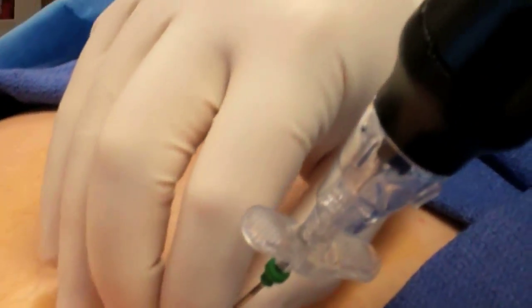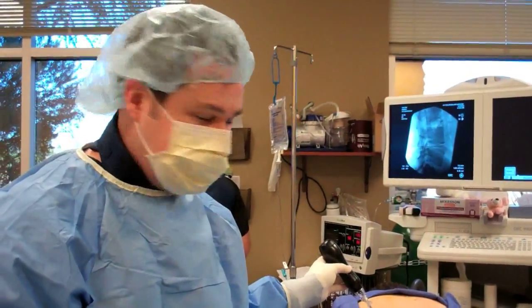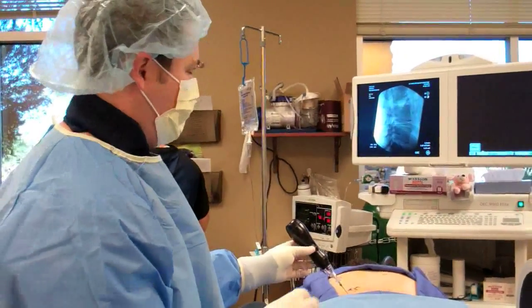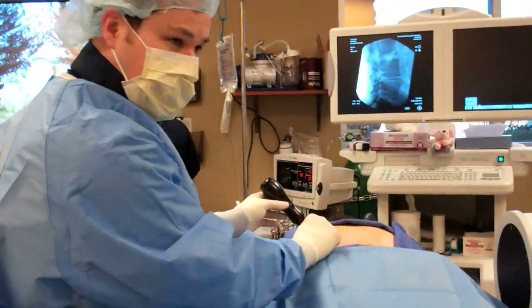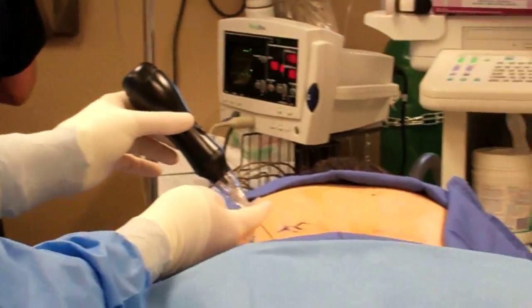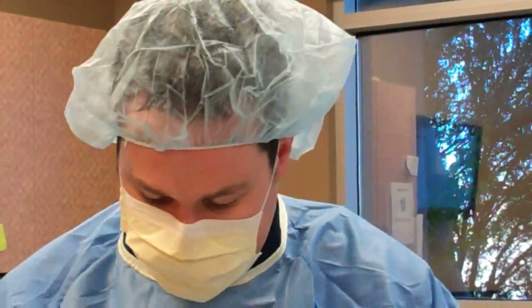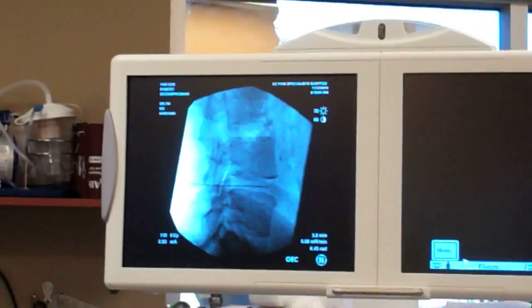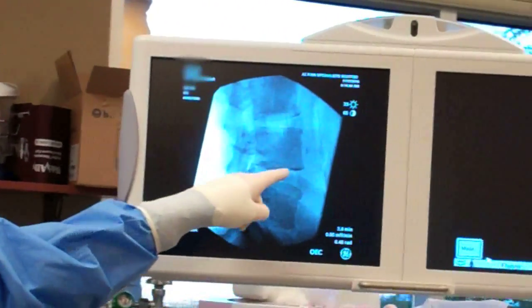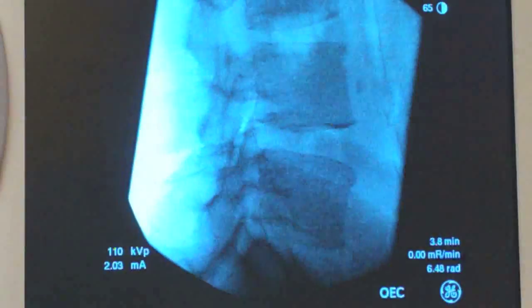What color is it? It's kind of a white-gray color. Okay, that's three 60-second cycles. We're going to go ahead and turn it off here and withdraw the whole system. You're going to feel some pressure here. You don't want to re-cannulate because it will push the disc material back in. So you just keep it attached and draw back — and we're all done. And that's the system that's come out there. We went right in the central part of the nucleus pulposus of that L4-5 disc. He did perfect — I hope this really helps him out. Thank you.